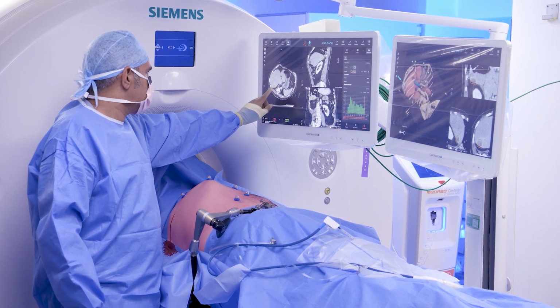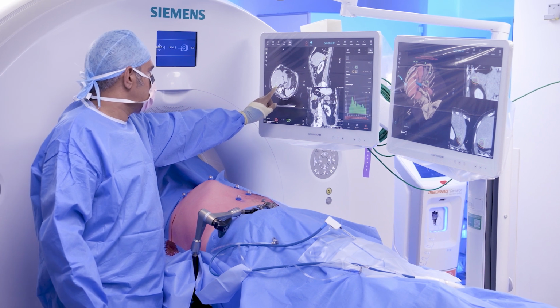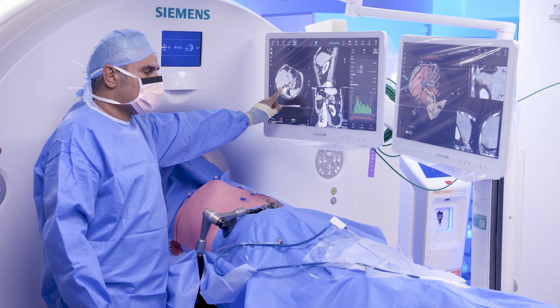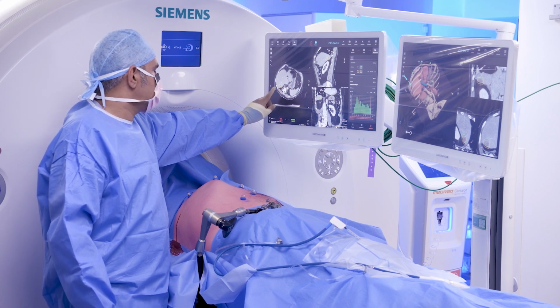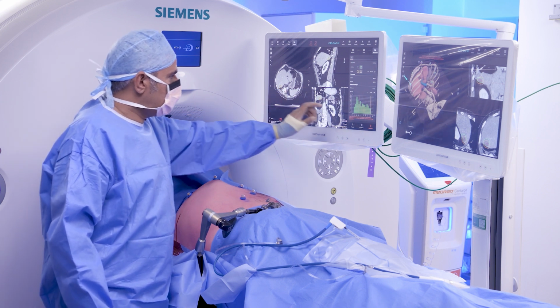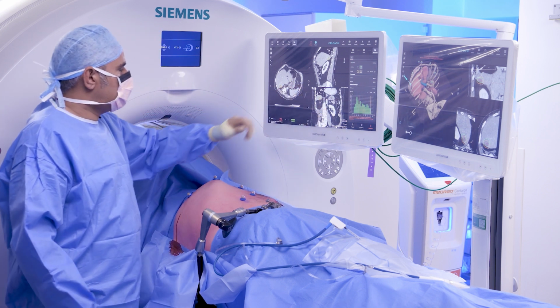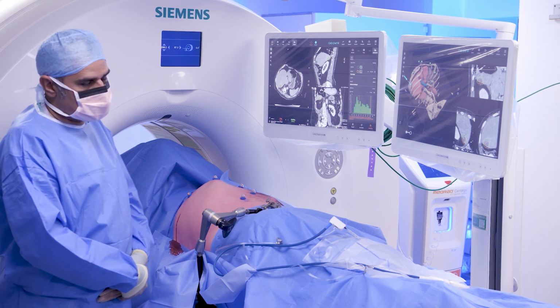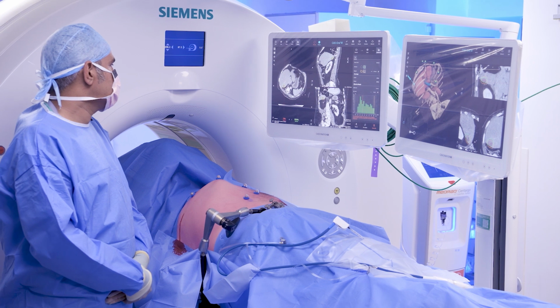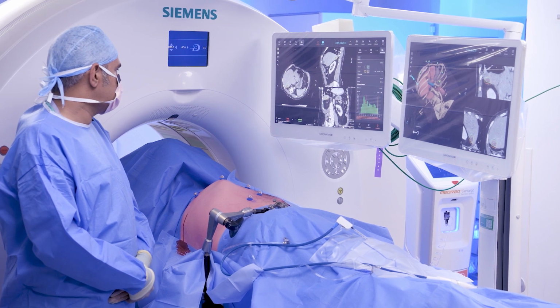Nevertheless, I'm satisfied with this because the margin that has been segmented of the ablation zone extends to the edge of the liver, and therefore I'm confident that despite the overall number that's been given, we've covered this tumor satisfactorily, and we should not expect a local recurrence at this site.